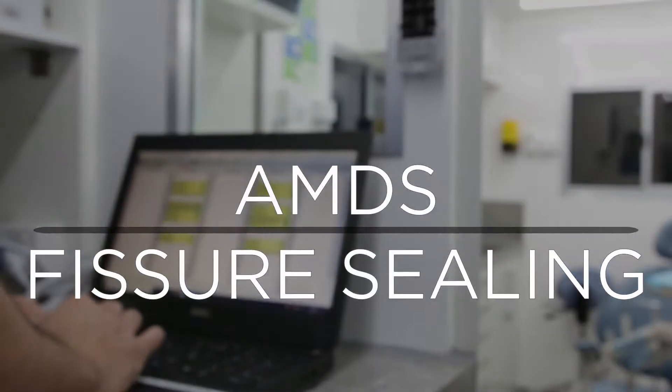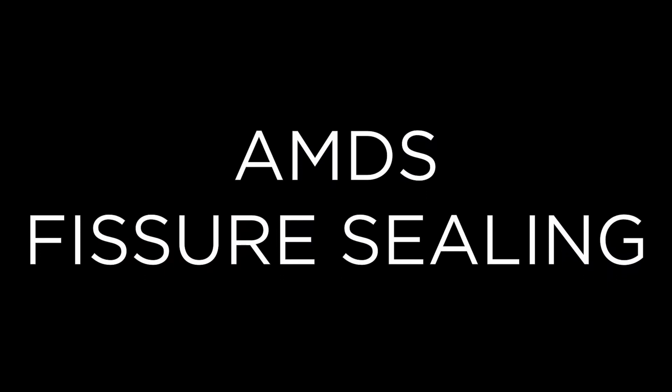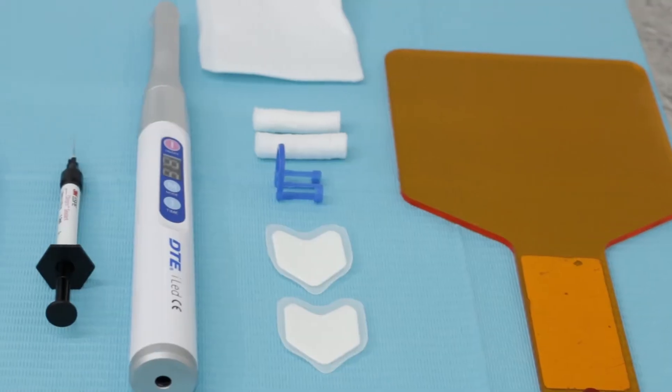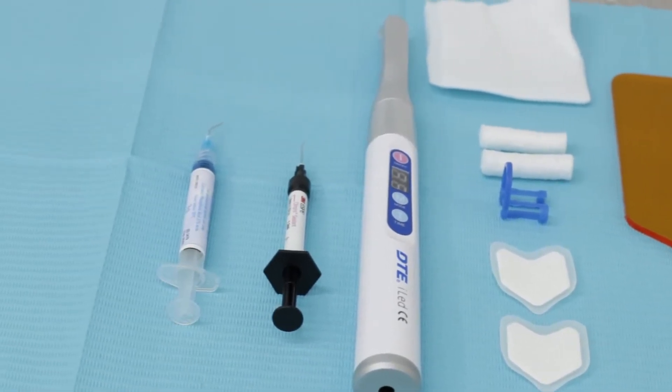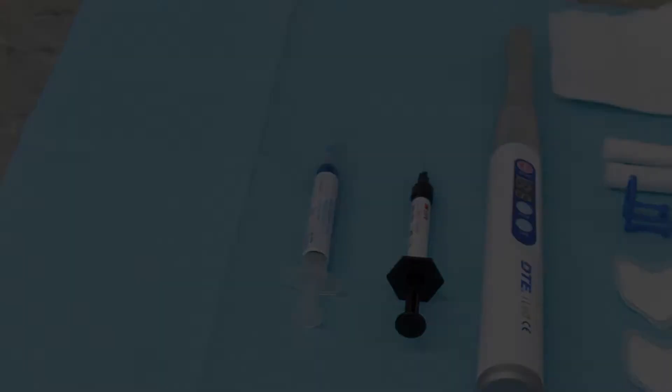Welcome to AMDS. Let's go over the fissure sealing procedure. A fissure sealant is a material placed in the deep pits and grooves of the teeth in order to prevent the development of tooth decay.